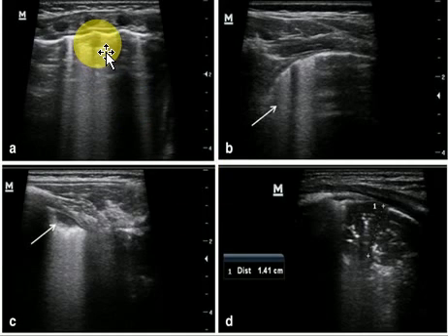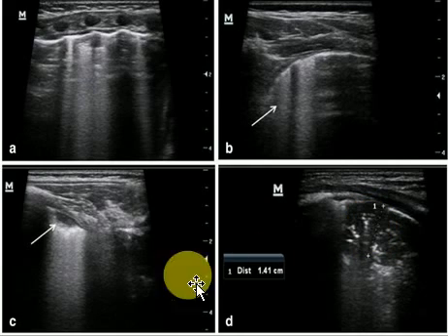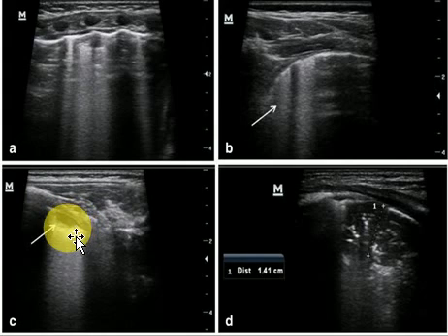See, this is the anterior consolidation, this is the compact B line, this is the anterior or subpleural consolidation. This is the compact B line, this is the consolidated area. See, the black one is the tissue-like sign, the small dots inside here are the air bronchogram. See, this is consolidated area, with B line.